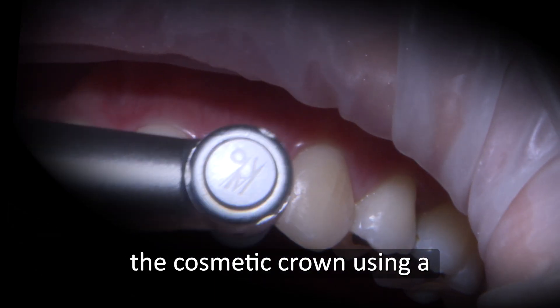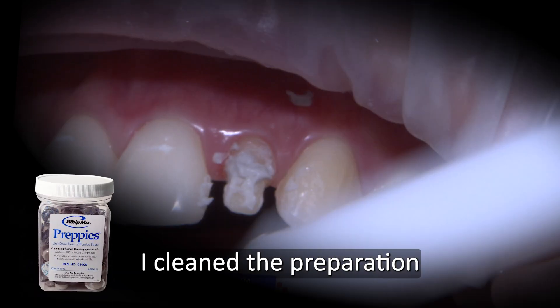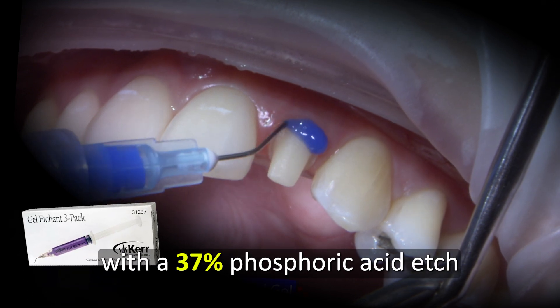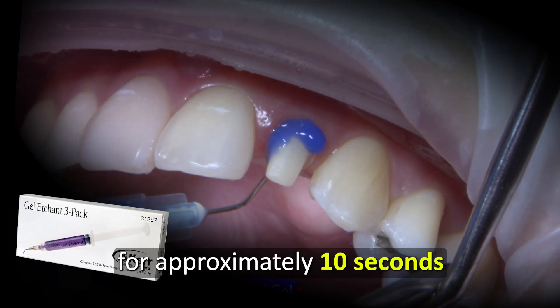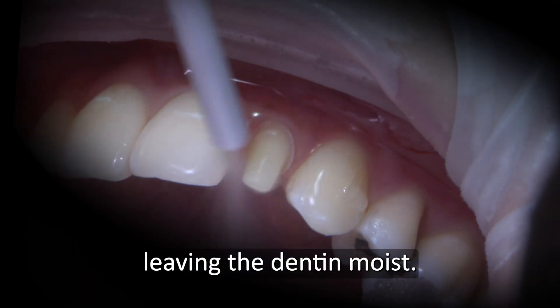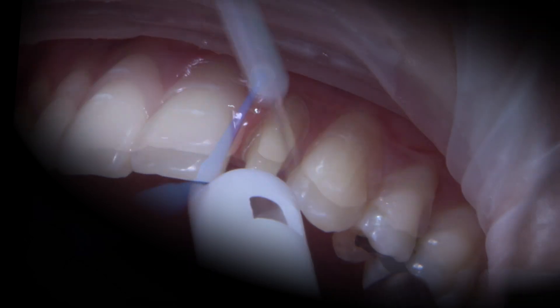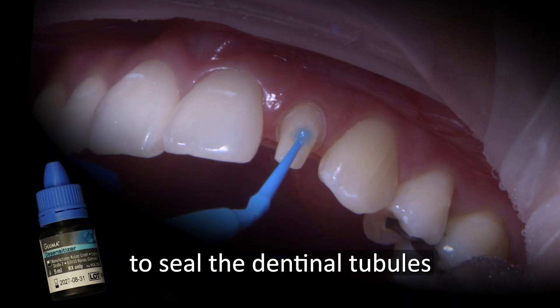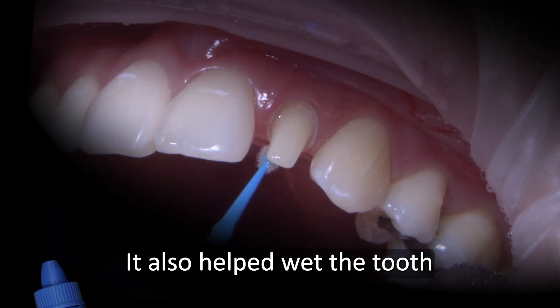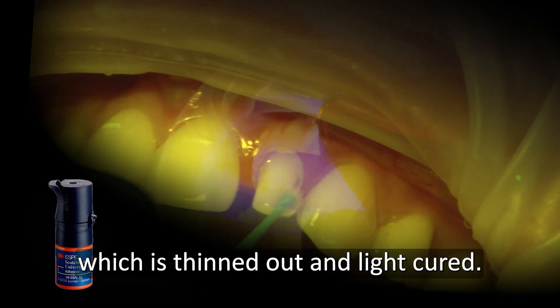With the patient's approval, we are ready to deliver the cosmetic crown using a bonded adhesive cement protocol. I cleaned the preparation with Pumice Preppy's slurry to remove any residual temporary cement. Then I treated the tooth with 37% Phosphoric Acid Edge for approximately 10 seconds, followed by copious water rinse for 20 seconds and air dry leaving the dentin moist. I avoid desiccating the tooth, which might cause post-operative sensitivity. I desensitized with Gluma to seal the dentinal tubules and provide an antimicrobial effect. It also helped wet the tooth to prepare for the 3M Scotch Bond Universal Adhesive Agent, which is thinned out and light cured.